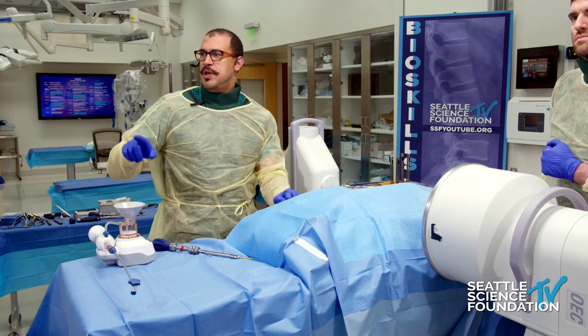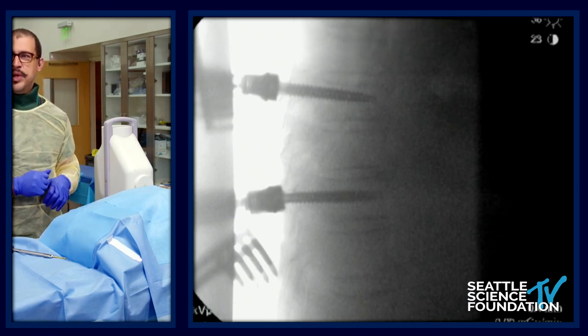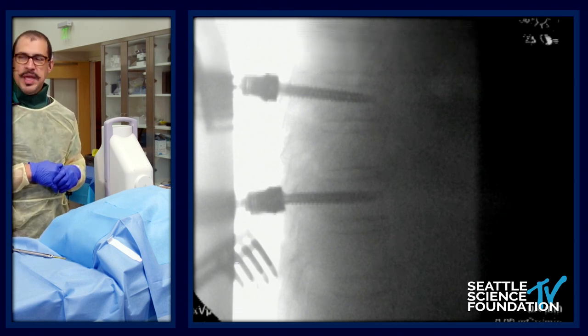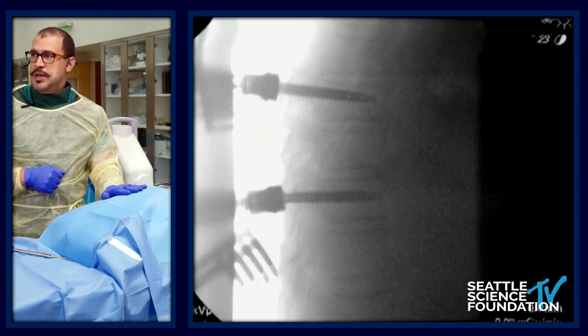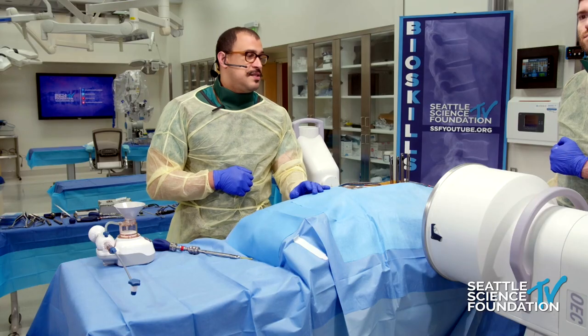So tell us, you're mixing your cement right now. Just to be clear, this is PMMA. So we will now get that cement going. Making sure screw placement is important — we will see it live. If there's any lateral placement of the screw, you can have lateral extravasation. We worry about embolization of that cement if it's very liquid, so making sure that the cement is at the right consistency.